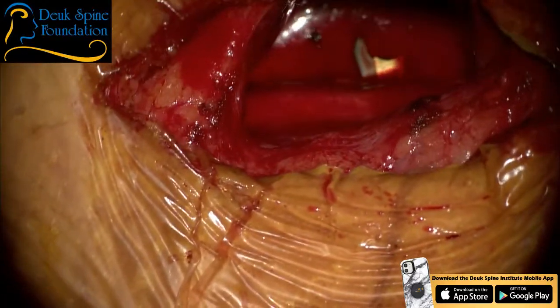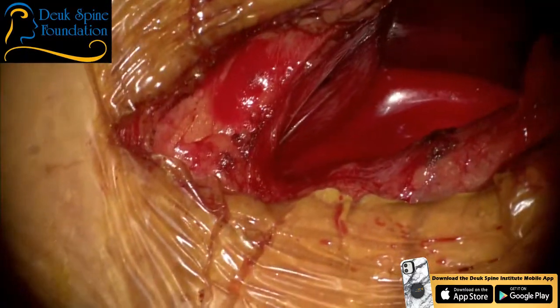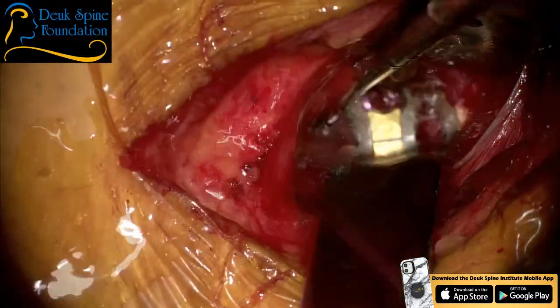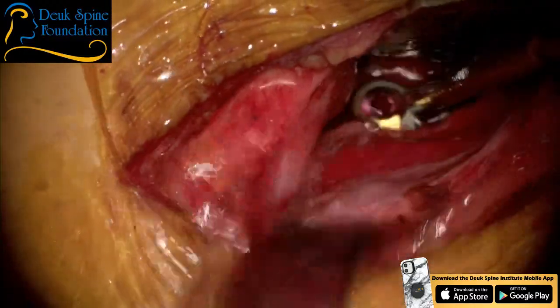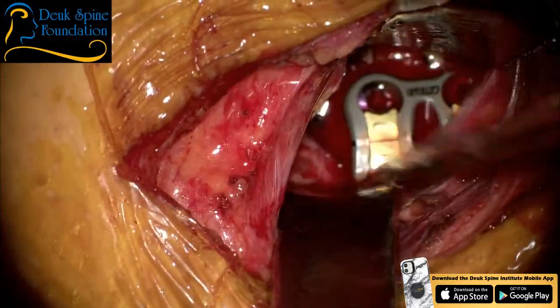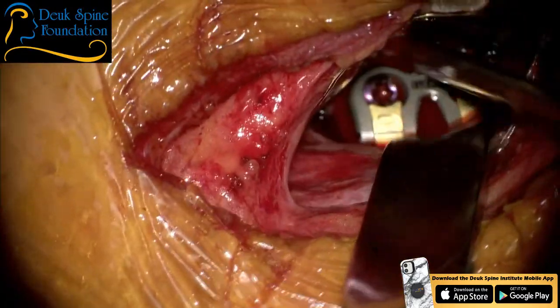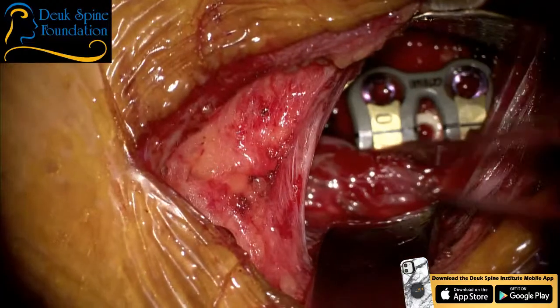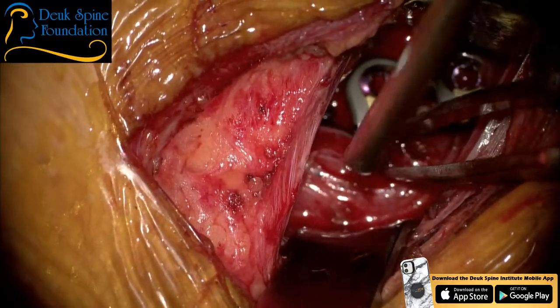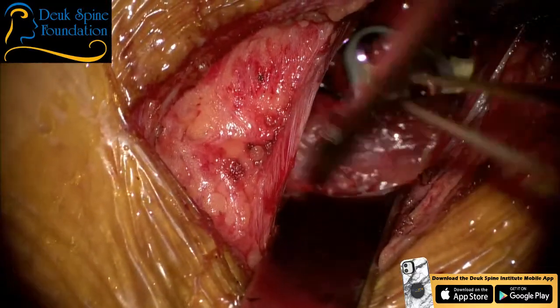It's going to take a little while to get all the hemostasis. Come on, irrigation. Come on, Patel. When I put it there, you got to lock it in. Suction. I need a bipolar ready. Show me where the bleeding is. It's probably coming. I need more irrigation. You see it, Patel? There it is. I need in. You got to move your hand. I need to see where it's bleeding here, Dr. Patel. Please suck here. Come on. You got to use the sucker on your other hand.